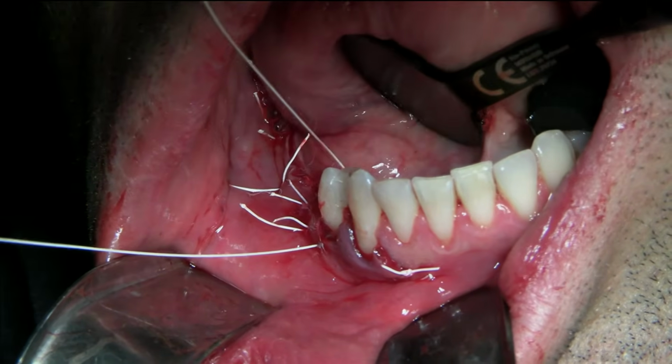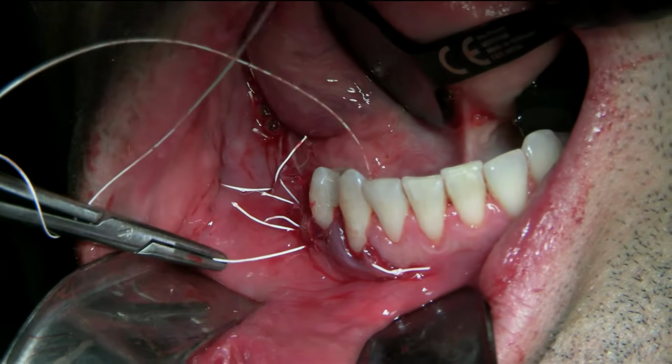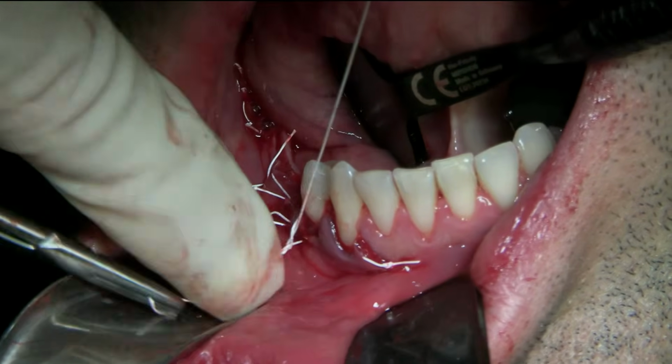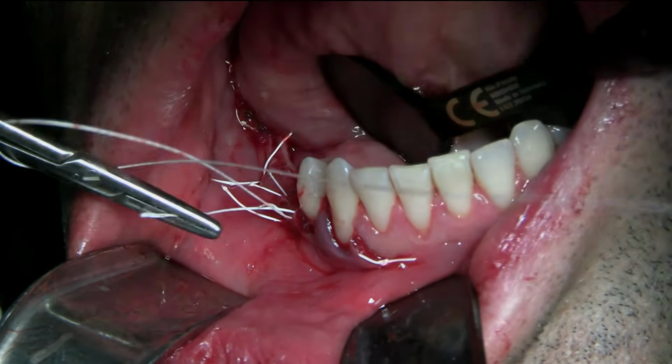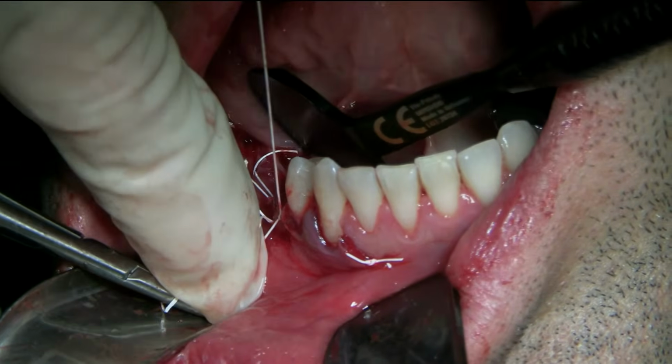And this suture will basically close the papilla distal of this premolar and seal the entry for any bacteria coming from the natural teeth. So this is an important suture.